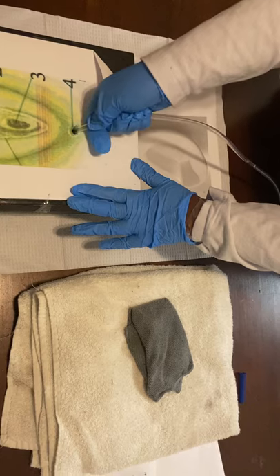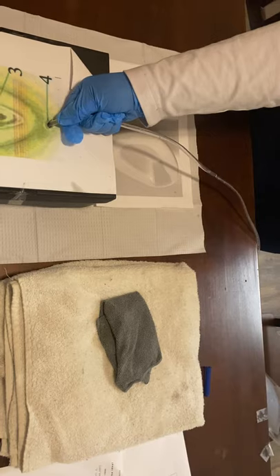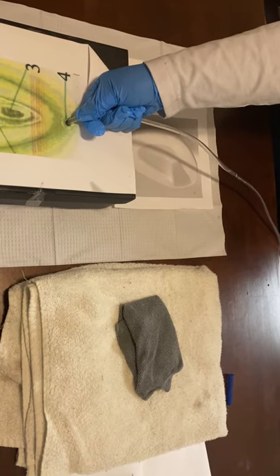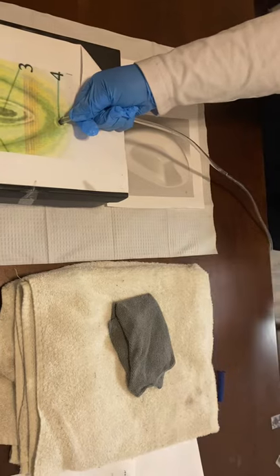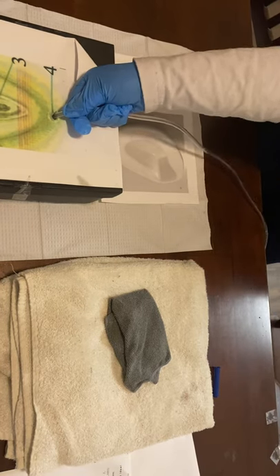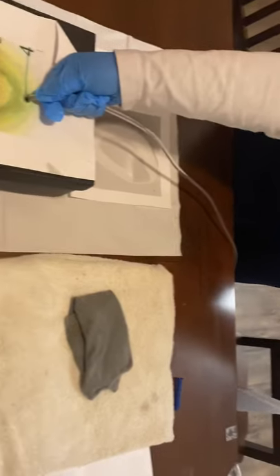I'm going to state that if the patient is experiencing any discomfort or trouble during this procedure, they can breathe to relieve some of that discomfort. I'm also going to verbalize that I spread the buttocks, and then I'm going to unclamp my bag and raise it 12 to 18 inches, then lower and clamp back.